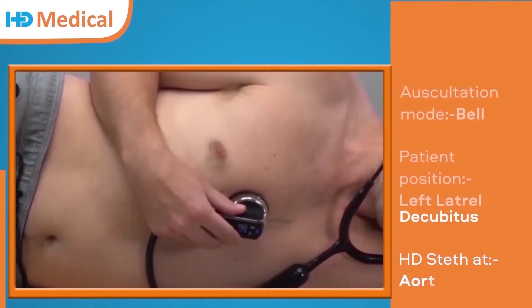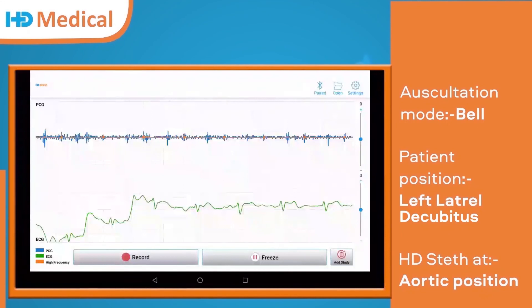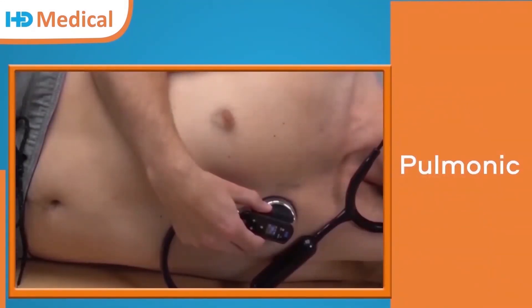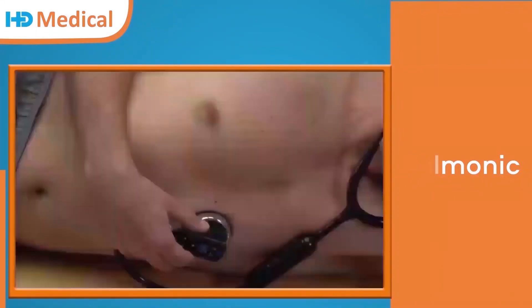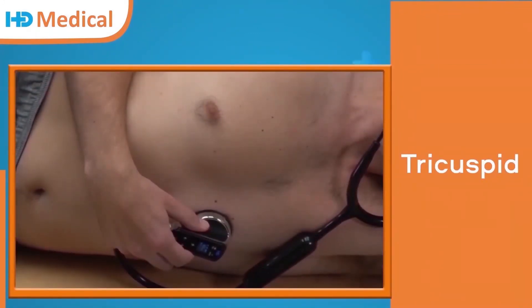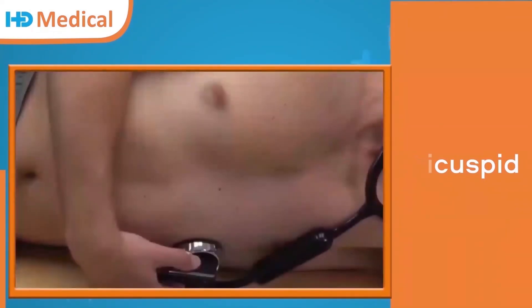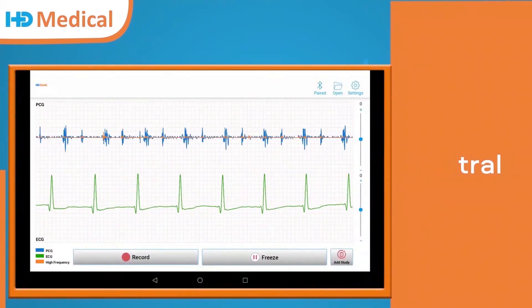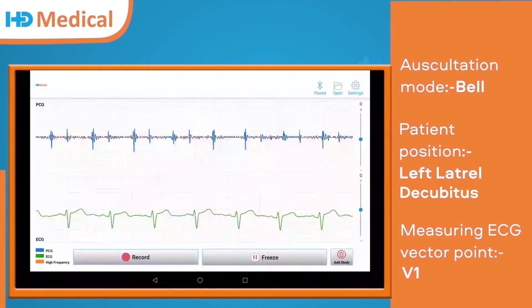Now I am measuring auscultation waveforms for the left lateral decubitus position. Aortic waveform. Now we are at the pulmonic position. Pulmonic waveform. Tricuspid position. Tricuspid waveform. Mitral position. Mitral waveform. ECG vector points for the left lateral decubitus position. V1 waveform.